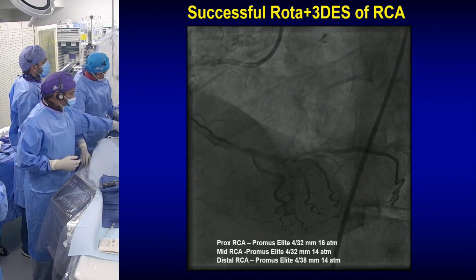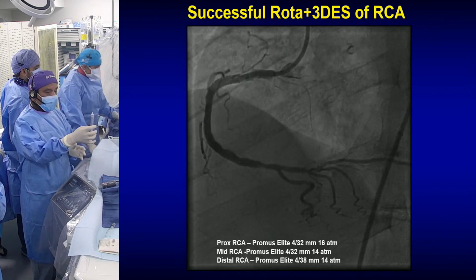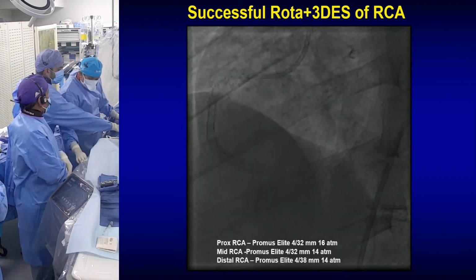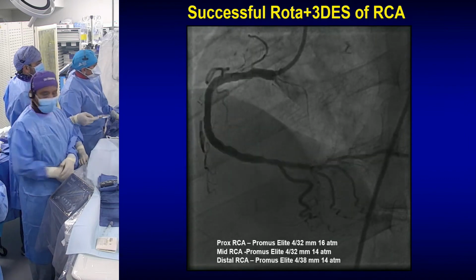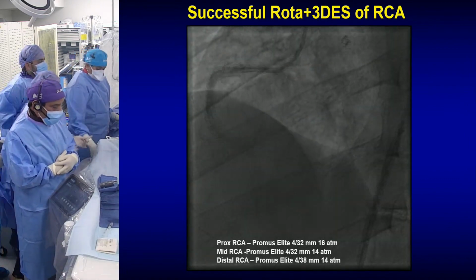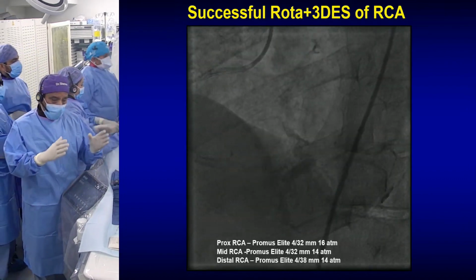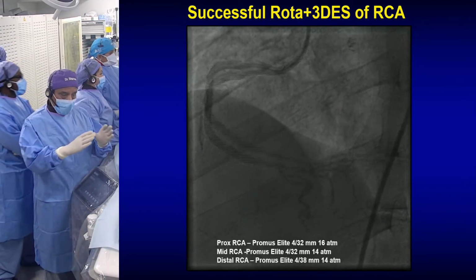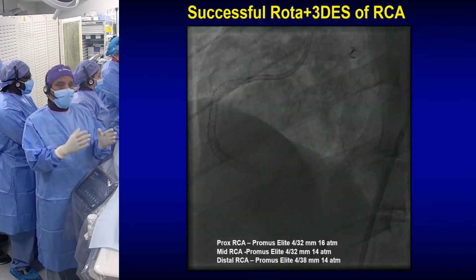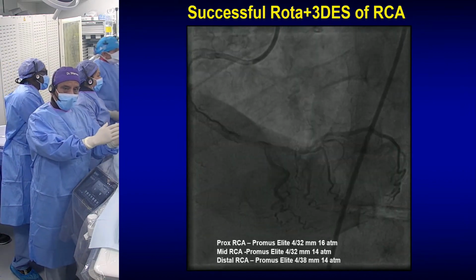To me, that allows you to use a smaller burr. In this case, 1.75 ideally is too small. It could have been 2.0 plus, but then you combine it with IVL. And we are evaluating our data on rotational atherectomy strategy, burr size, post dilatation, and more importantly how complications have changed in the pre-IVL era at Mount Sinai and post IVL.